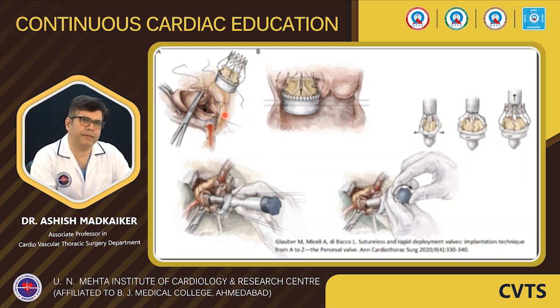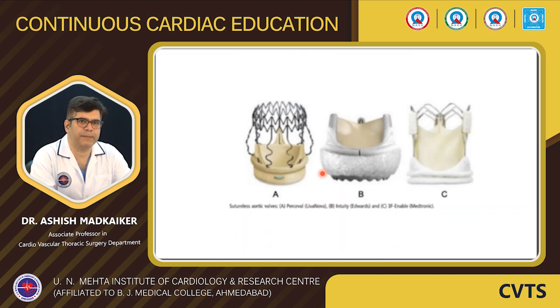So we might get a balance of both worlds with these valves. However, we still have to see the long-term results and how further development improves the scenario in sutureless valves. These are the different types of sutureless valves which are available and commonly found in practice.